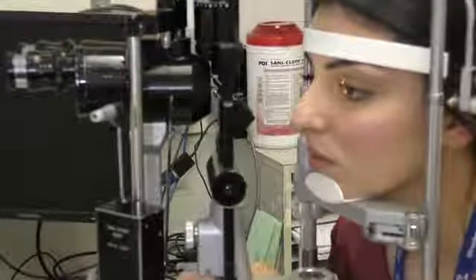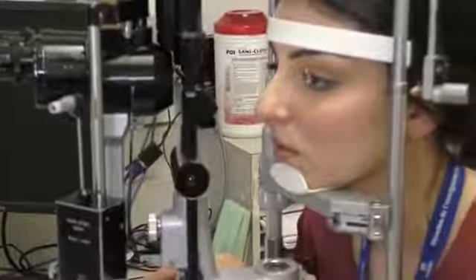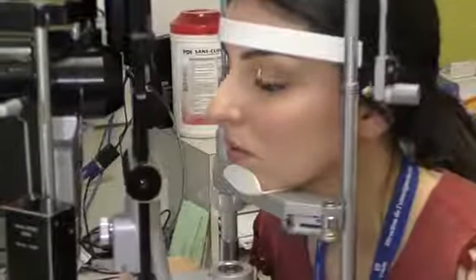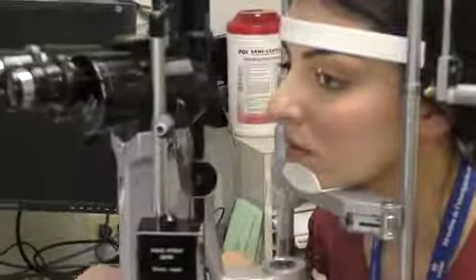Okay, so very important, because a narrow beam is very good, as I'll show you later in the video, to examine the cornea and different sections of the cornea. Okay, so that's very important. So next, we want to get this nice and centered.